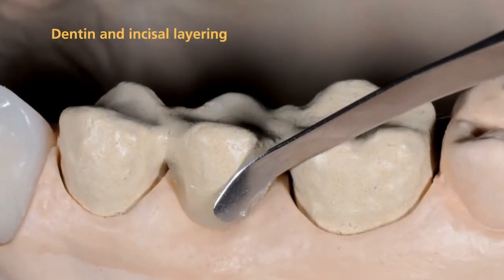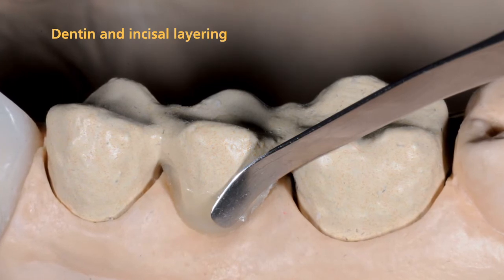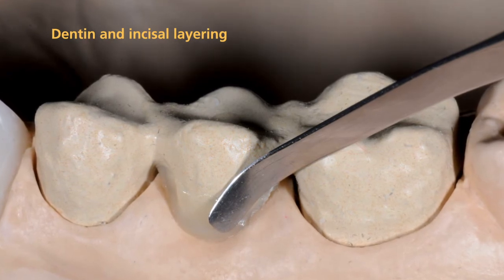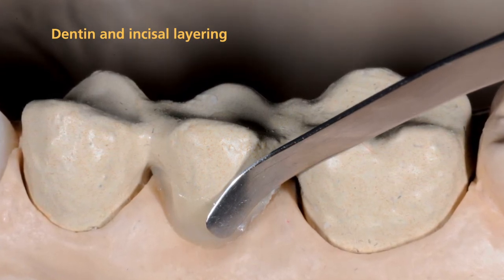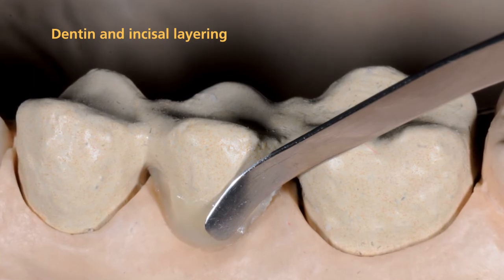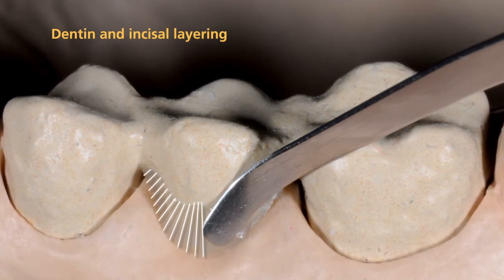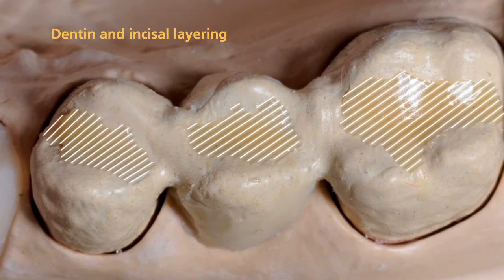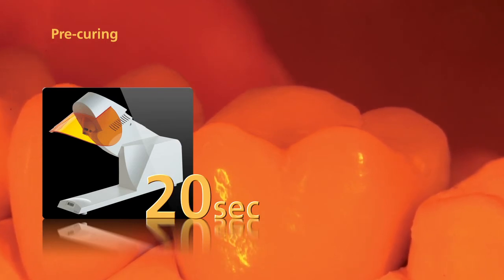Now you are ready to commence the layering procedure proper. The individual SR-NEXCO paste materials can be either applied according to the layering diagram or individually. Press the first layer firmly into place to achieve an effective bond between the composite and the opaquer surface. After that, build up the layers step by step. You may contour the basal surface of the pontic area with pontic fill. Occlusal dentin is particularly suitable for enhancing the occlusal shade effect. Consistently pre-cure the NEXCO materials with the quick for 20 seconds each segment.